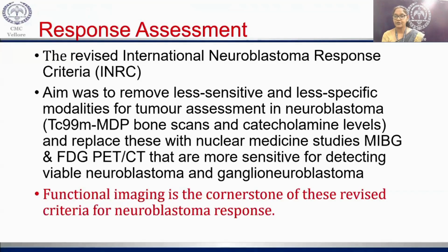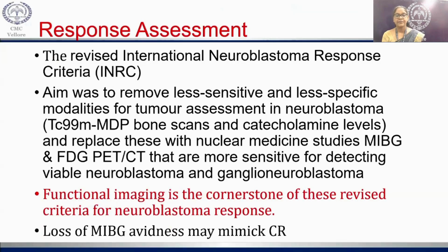Functional imaging is the cornerstone of these revised criteria for neuroblastoma response, and loss of MIBG avidity may mimic complete response, whereas it is not complete response.